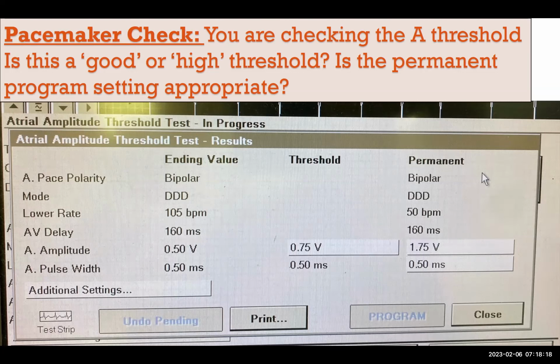Because some of you who've seen these cases with me and with Barry, I'm sure have noticed that oftentimes the lead is encased in a lot of scar tissue. And so we have to do a lot of dissecting of the lead. And though we try to be very, very careful, you could imagine that the risk to the lead is not nothing every time you take it in and out. So if we can reduce the exposure of the device and the lead to people like myself or Barry, that's to the patient's benefit. So we're always looking at ways to sort of squeeze the orange as much as we can to get as much juice out of it.